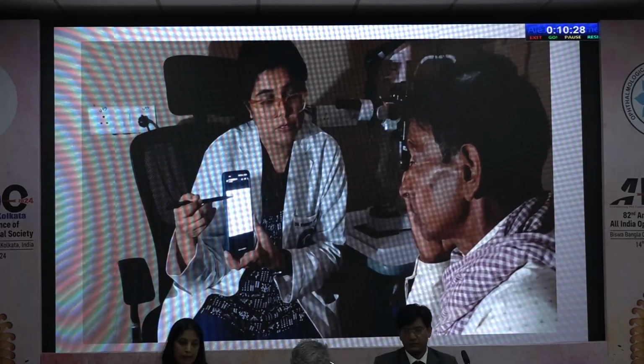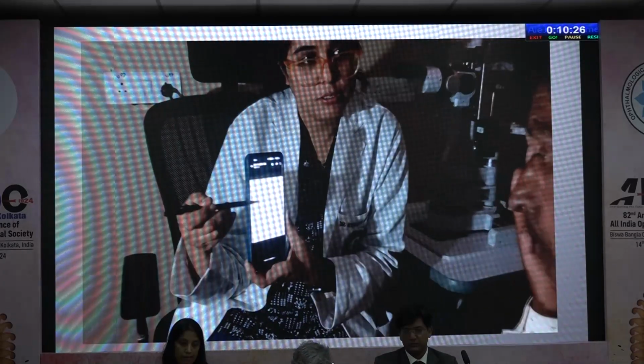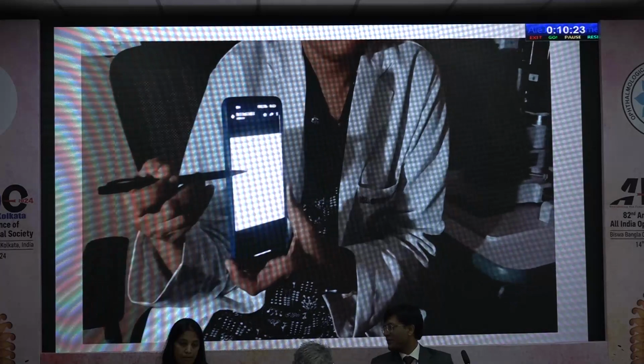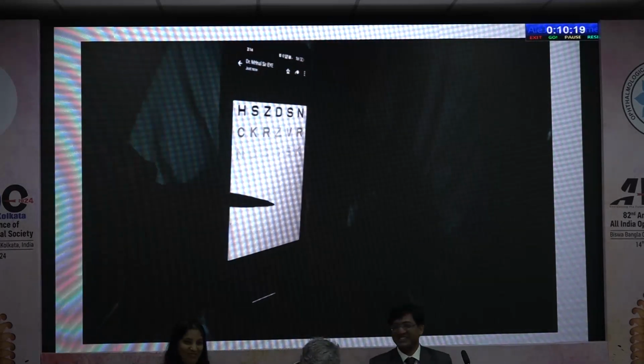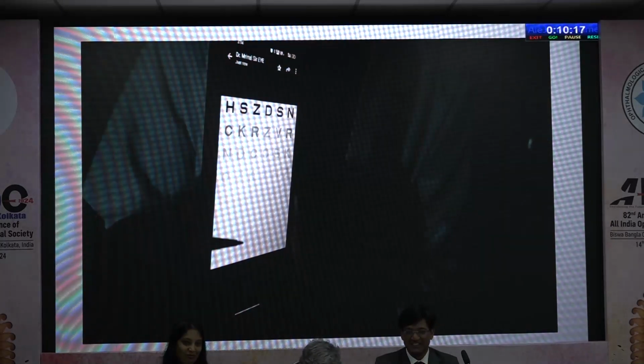In this video, our undergraduate student is performing Pelli-Robson contrast sensitivity testing. This patient is suffering from cataract, so he is able to read the upper 2 or 3 lines, but he is unable to read the lower lines.